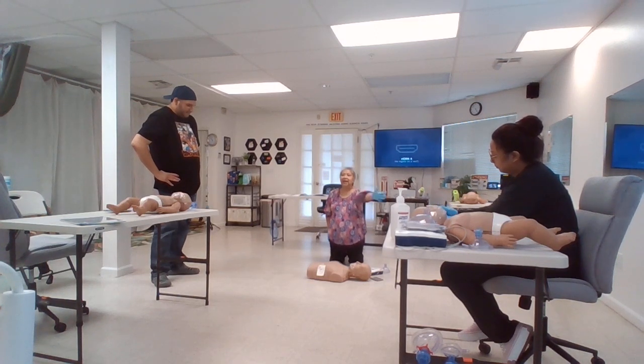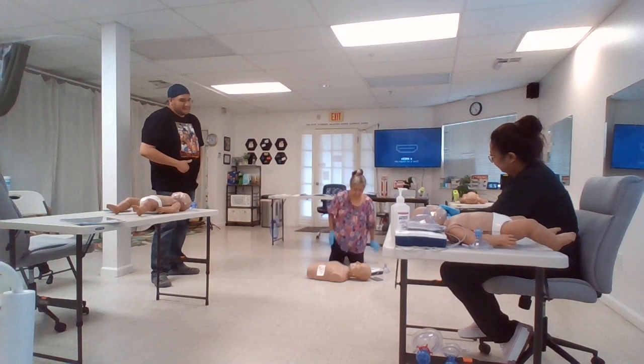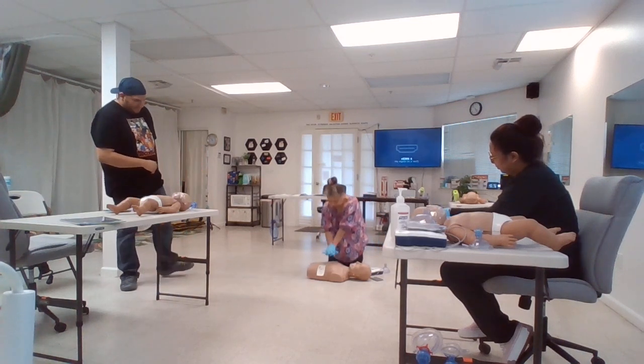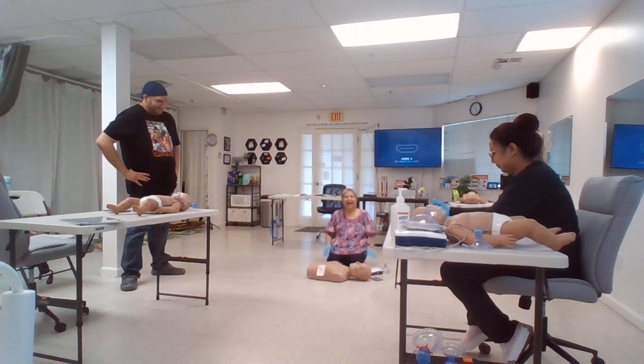Do not touch the patient. Everyone clear. Press the flashing shock button. Shocking, clear. Shock delivered. Begin CPR. 1, 2, 3, 4, 5, 6, 7, 8, 9, 10. Cristina, good job.